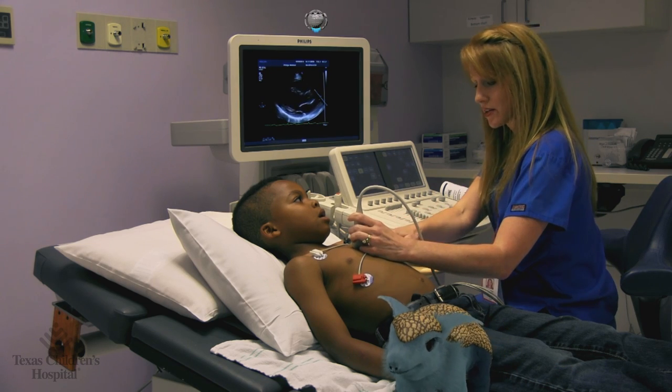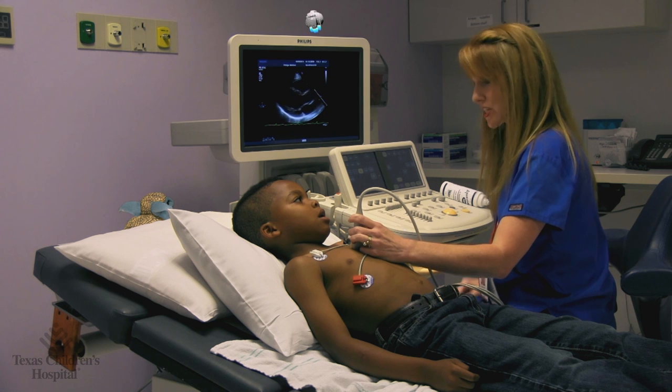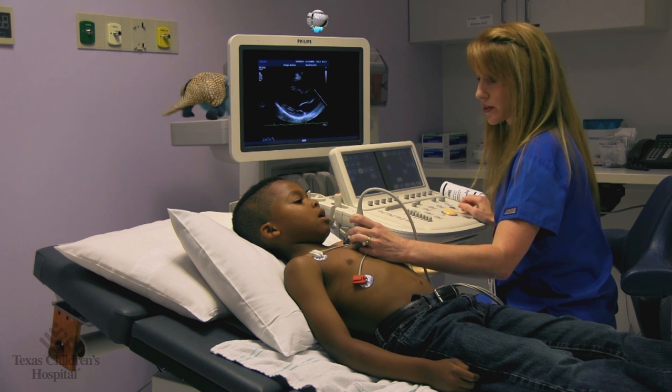We take pictures from here, and then some from down here, and then some from your tummy, and some from underneath your chin. We have to take pictures from lots of different positions to look at all of your heart.